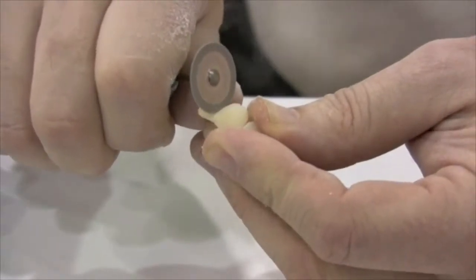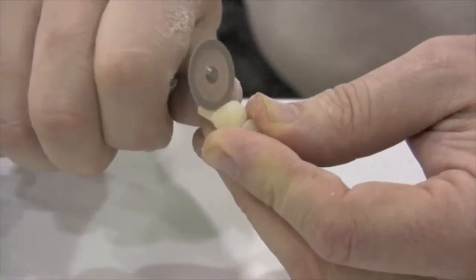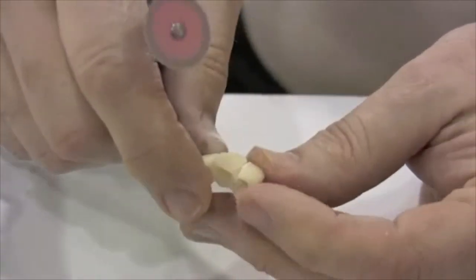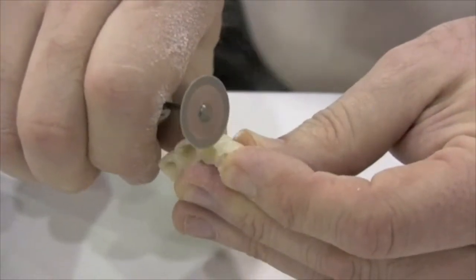Working on the facial embrasure first, then the gingival embrasure. Notice how nicely the material is carving.